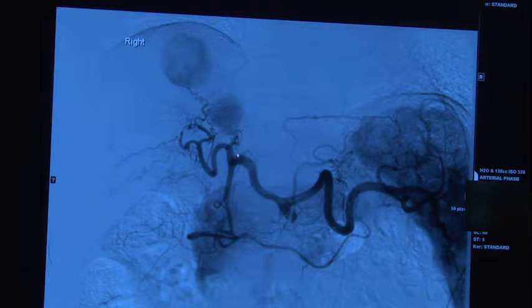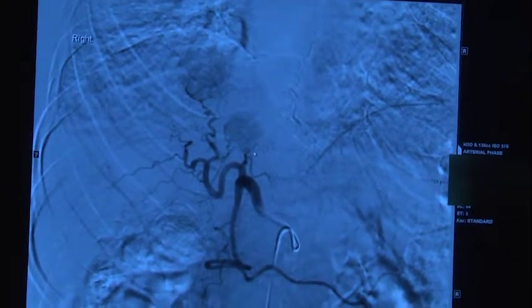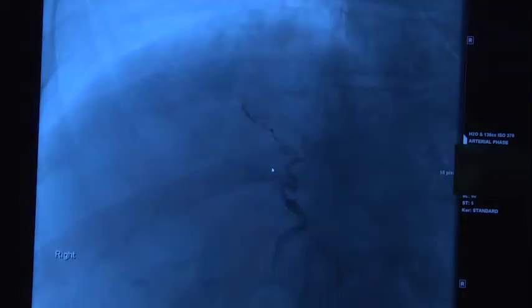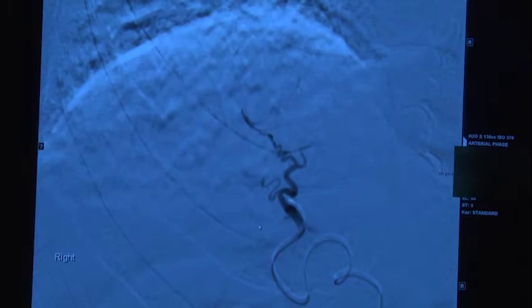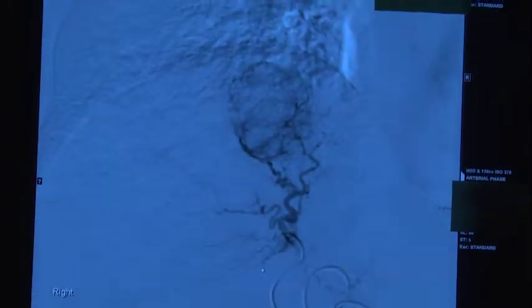So what's happening is these areas are hypervascular. That's our way of saying that these tumors have more blood supplied to them than, say, the more normal liver around them. Now we've gotten into the blood vessel that supplies more specifically the liver alone, and we eventually will take a small catheter into the blood vessel that supplies one of those two lesions primarily.